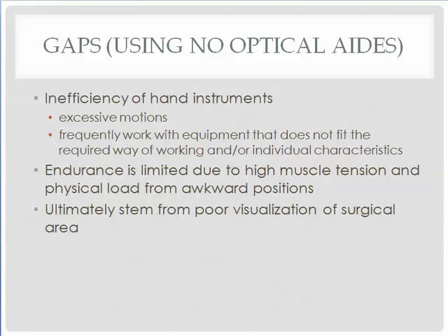Prior to optical aid advances, endodontists relied primarily on their eyes during surgery. Notable gaps were inefficiency in handling the instruments due to excessive motions and using tools for unintended purposes. Furthermore, high muscle tension and physical load was a result of having to use the tools in awkward positions for prolonged periods of time. Ultimately, these gaps are a result of the overarching poor visualization of the surgical area.